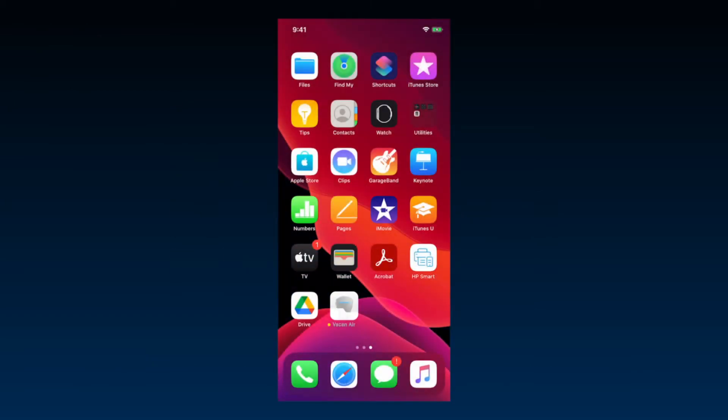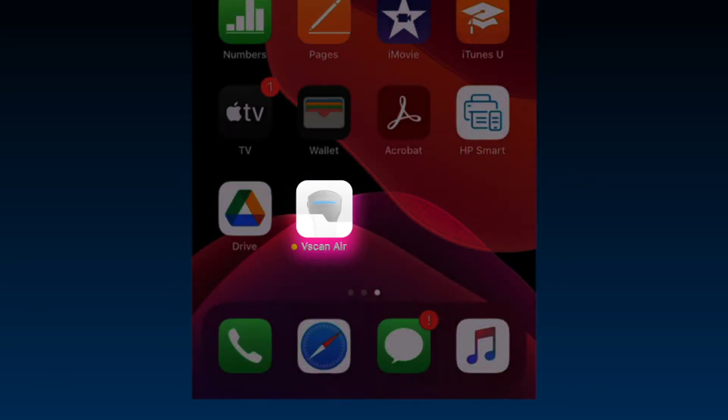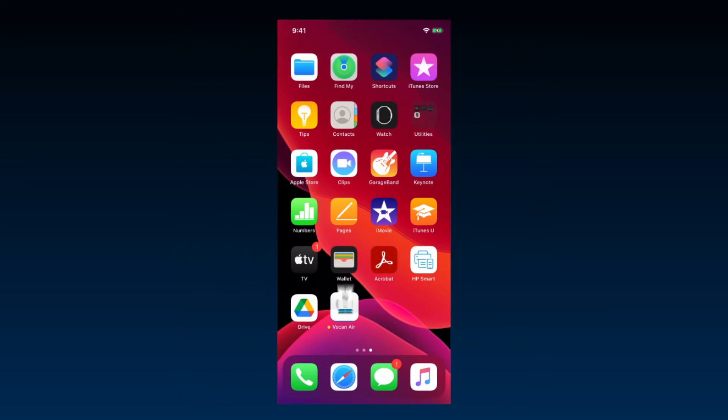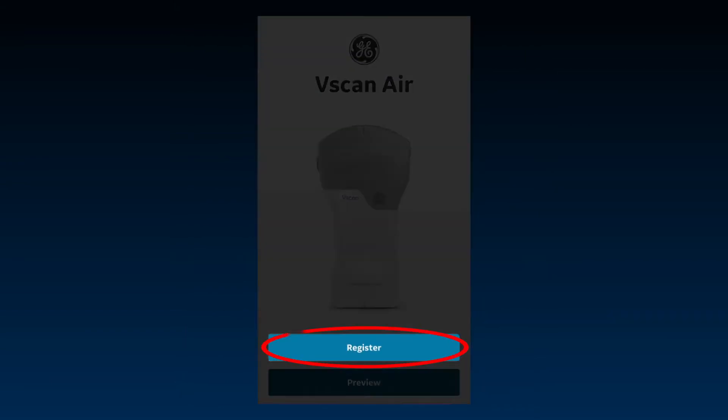To register your device, start the vScan Air app on your mobile device. Have the probe available and in the vicinity of the display device. Open the app and press Register to begin account creation.